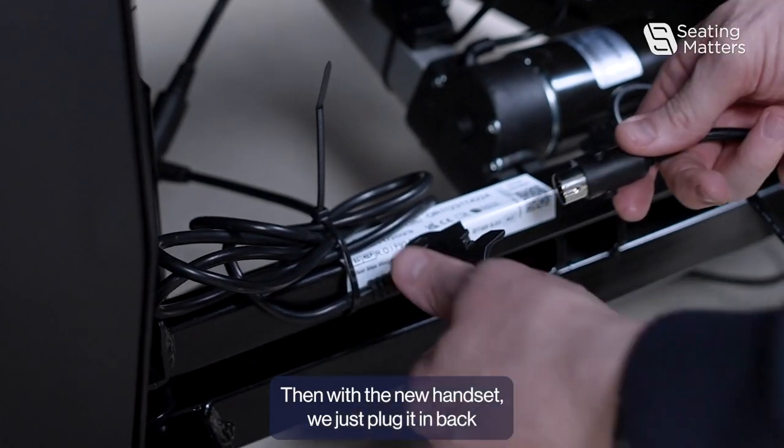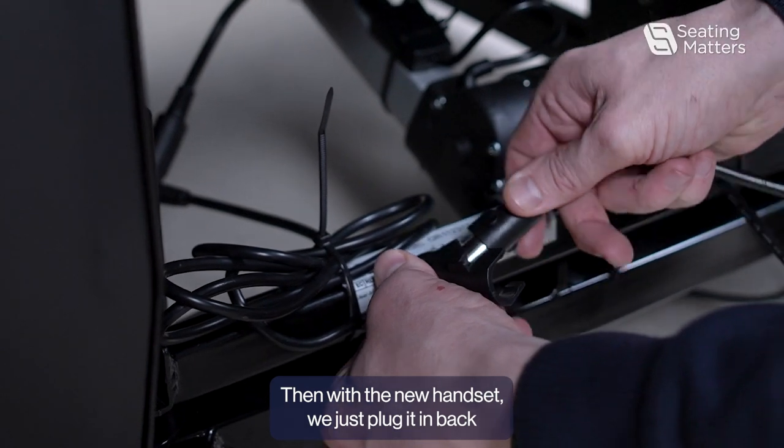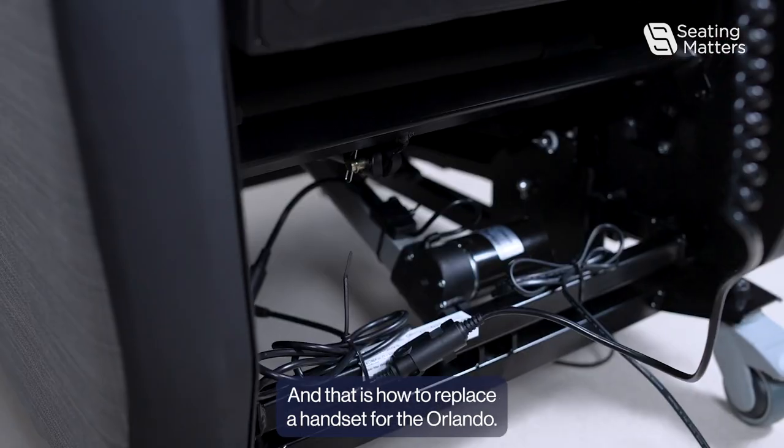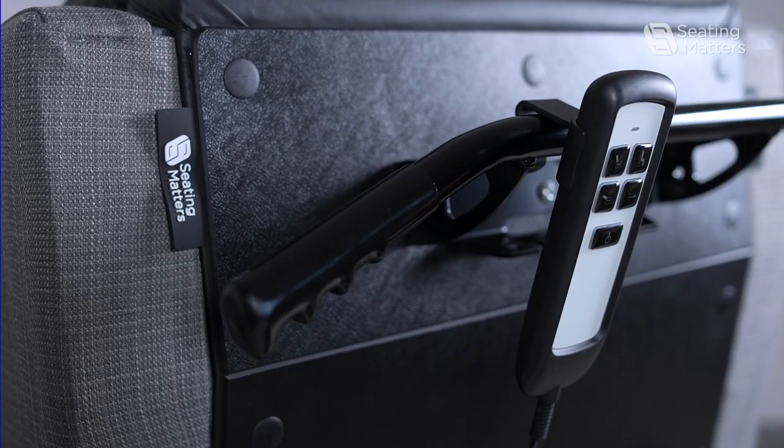With the new handset, plug it back into that connection and close the plastic cap. That is how to replace a handset for the Orlando.